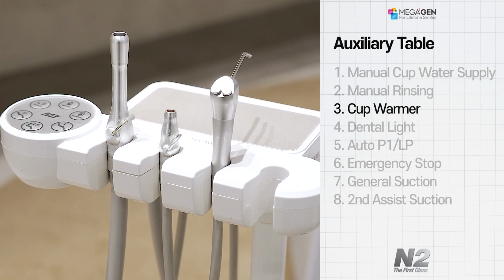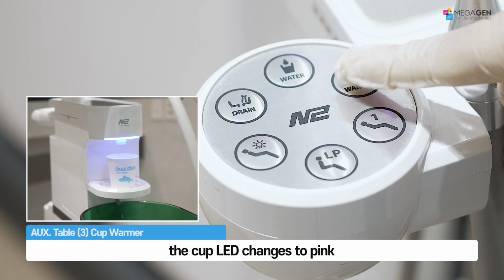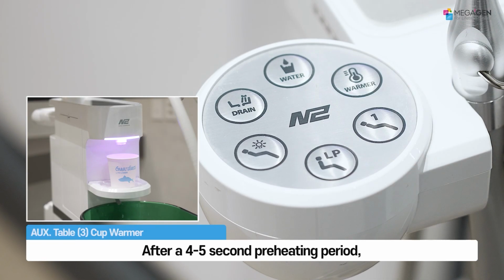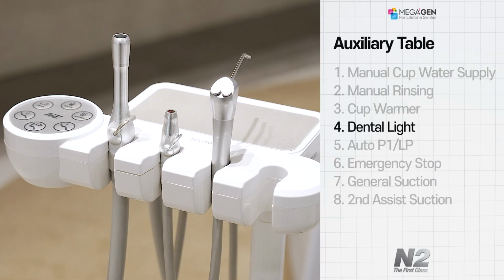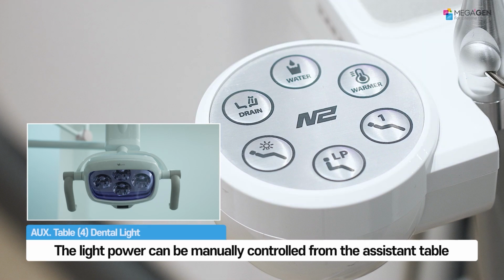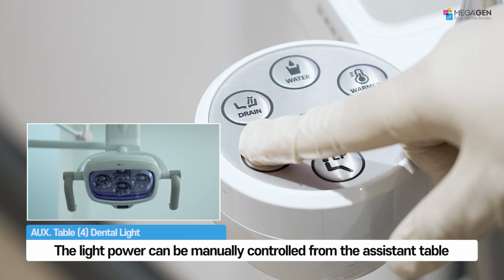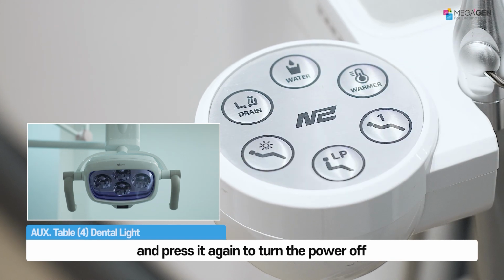Automatic cup warmer function. When you press the warmer button, the cup LED changes to pink. After a 4 to 5 second preheating period, the water is supplied at a maximum temperature of 42 degrees Celsius when the cup is placed. Dental light power function. The light power can be manually controlled from the assistant table. Press the light button to turn the power on, and press it again to turn the power off.